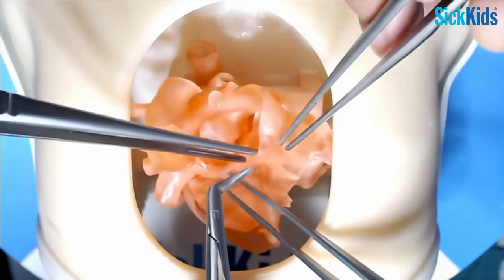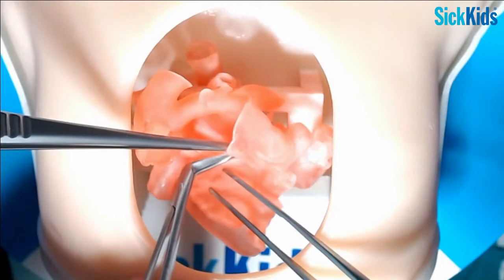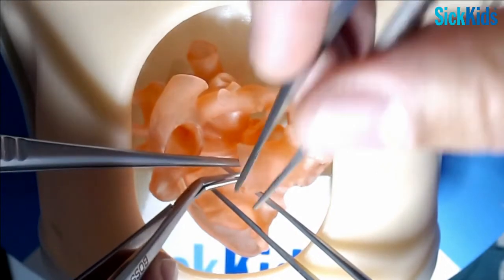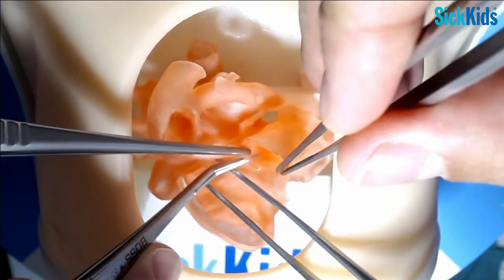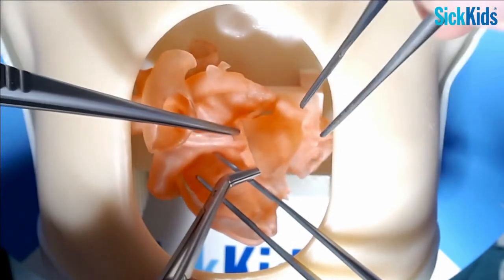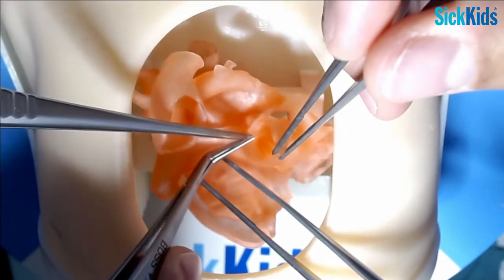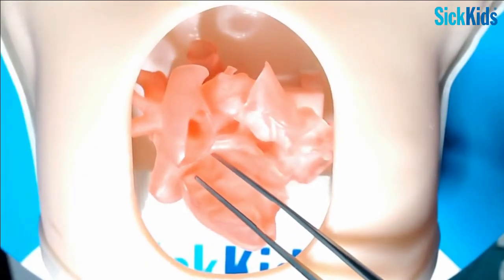Then I look inside, let this sit naturally, and see where that abuts it. So right there is where it abuts it, and you want to look inside here, and you can see that it's anterior to the commissure. Sometimes it's posterior to the commissure. You cut back usually across the sinotubular junction so that those two can come together in a side-by-side kind of V way. Just because this stuff is stiff, I'm going to take a little bit out. So that's all your cuts.